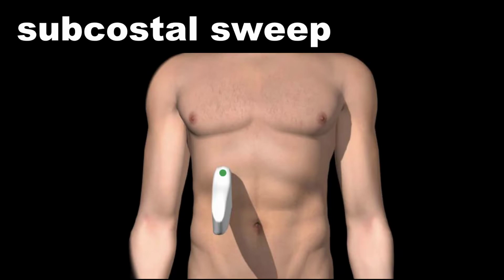So I typically start with the subcostal sweep method. This is done by putting the ultrasound in the patient's epigastric region with the indicator pointing first up towards the patient's head. And then I do this sweep underneath the patient's rib cage from the epigastric region until I reach about the end of the right upper quadrant. In most cases, the gallbladder lies posterior to the inferior margin of the liver, and you'll find it somewhere around here in the midclavicular line.